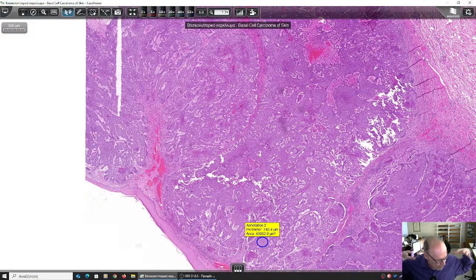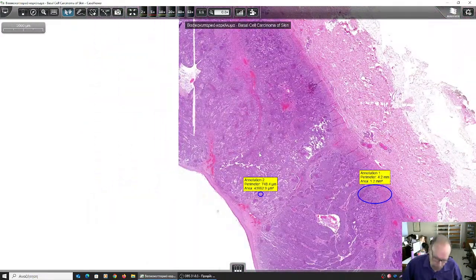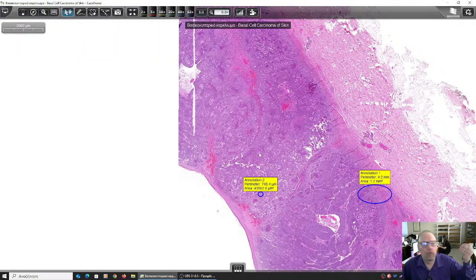It has an endophytic and invasive pattern, not just endophytic, because everything that is endophytic is not malignant. But if we have invasion, this favors malignancy. So this is an invasive tumor with increased mitotic activity of basal layer derivation.